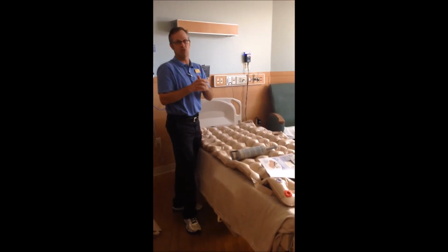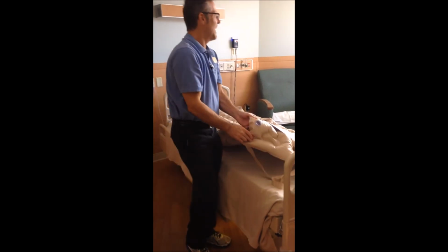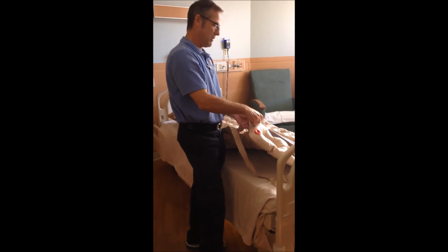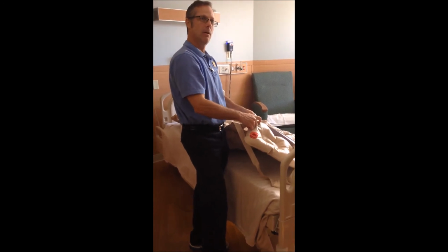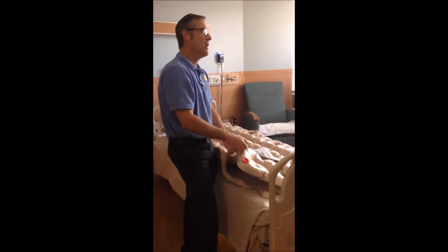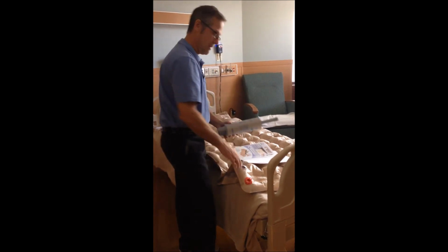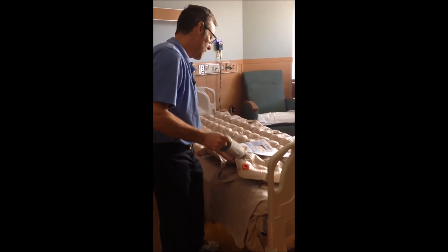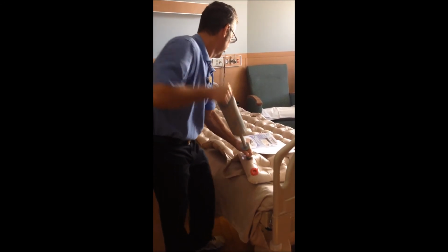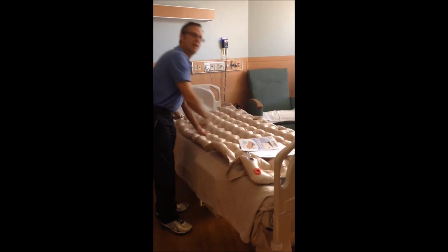If they ever complain that it's too hard or not comfortable, the clear valve is where we inflated it. Remember, red is rapid deflation. Just take your finger and you can tap a little bit of air out, so you can easily adjust the air for your patients. If they ever complain that it's too hard, maybe someone didn't see the in-service, looked at it, thought, whoa, that needs some air in it, and put some air in it. Well, I'm going to show you if you overinflate it. Never want to hear that.